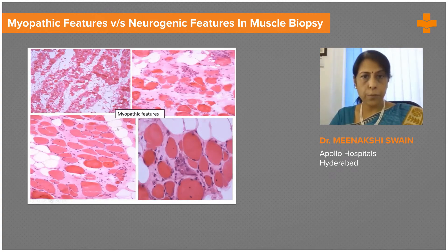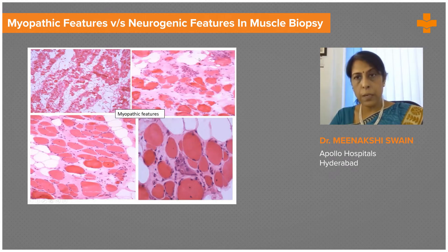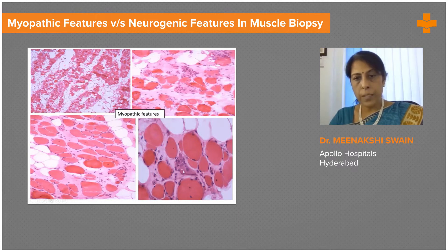Let me show you a few pictures to reinforce what I've just said. This extremely low-power view shows fatty infiltration and complete loss of fascicular architecture — fascicles disrupted by fat and fibers separated by fibrous tissue. At higher magnification there is marked variation in fiber sizes, fibrosis, and fatty infiltration. You can see pale necrotic fibers — a focus of myonecrosis with phagocytes ingesting them, i.e., myophagocytosis. Also visible are innumerable fibers with central nuclei, fiber splitting, and basophilic regenerative fibers with plump nuclei — all myopathic features.